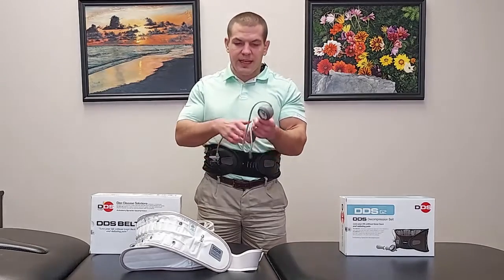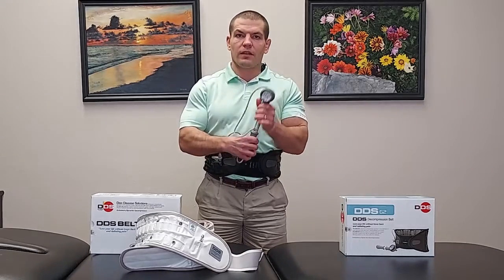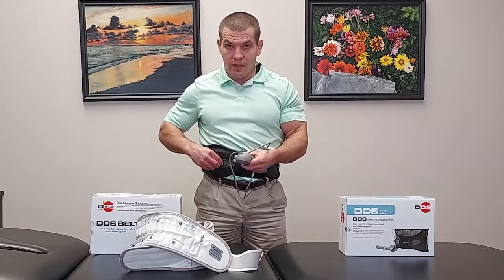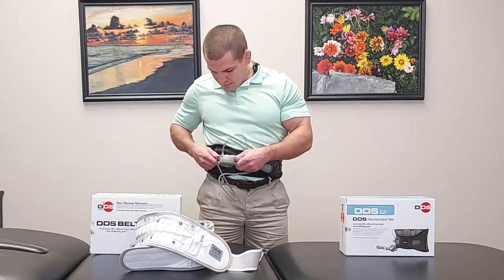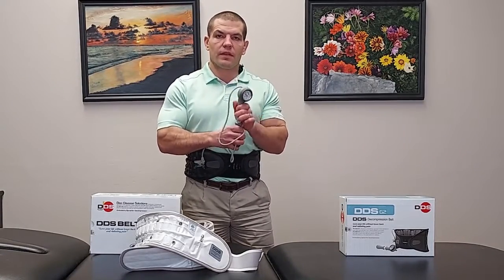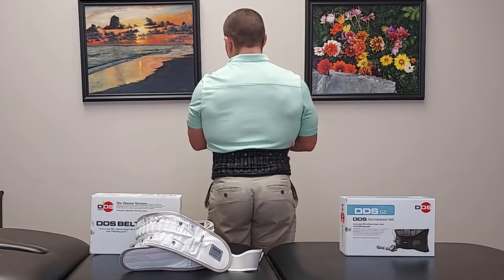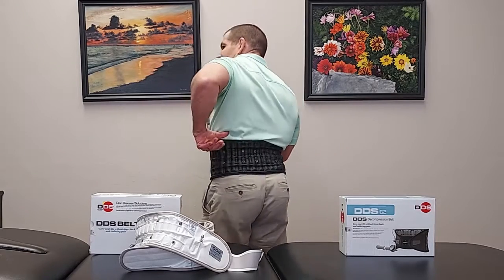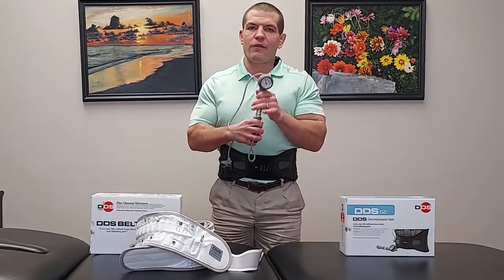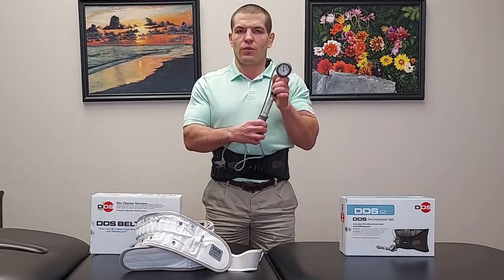You clip the same pump on — it works for both braces — and pump it up. You can see the air columns expand vertically and pump the brace up. For me, being a little shorter, I feel like this one slides up under or over my rib cage, so I don't personally get as much lift out of it, but that may just be due to my size.